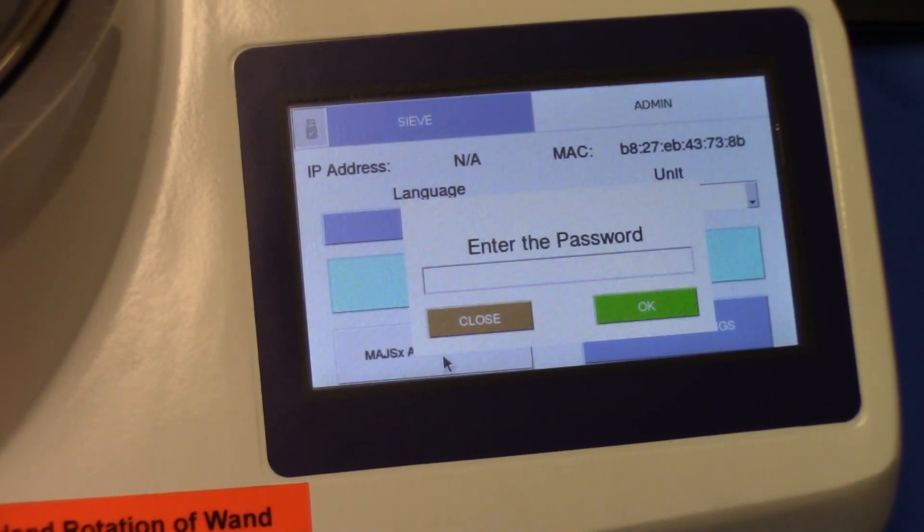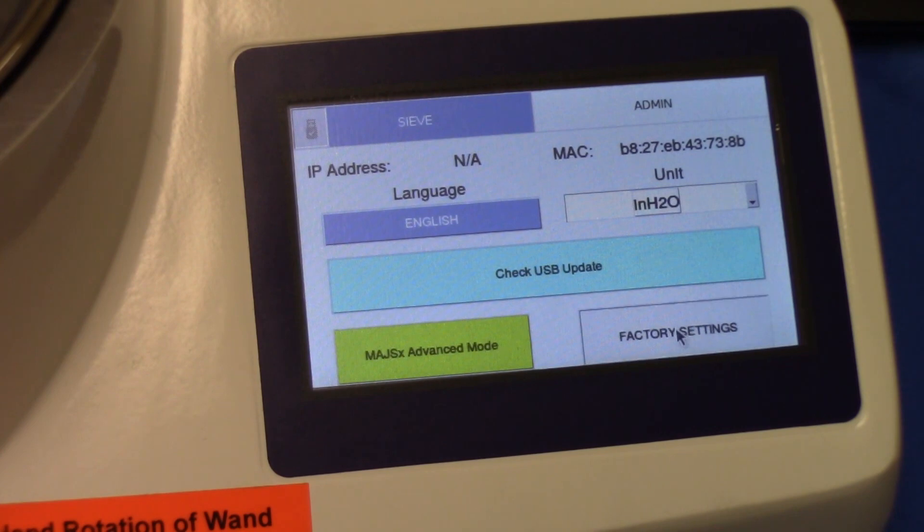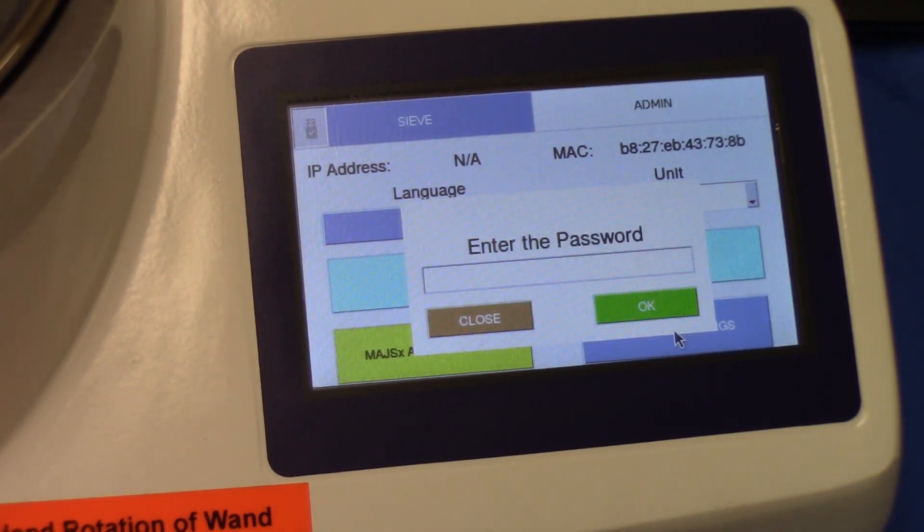Advanced mode takes the unit three steps further. It allows the client to use a compatible balance and any printer, so analysis information is stored not only on the memory card but also on a USB stick. However, it is password protected. Factory settings also require a password. Factory settings are just that — settings that the factory should have access to, and they are not settings we recommend clients use.